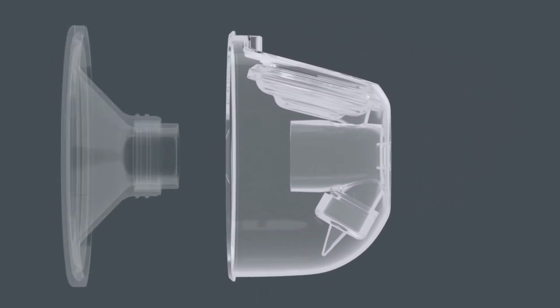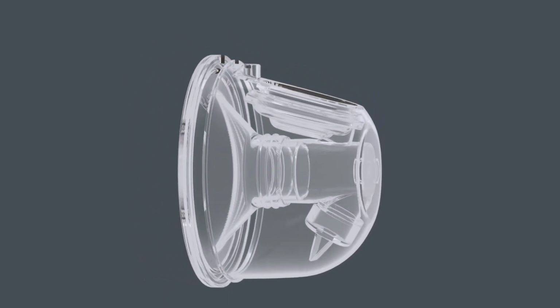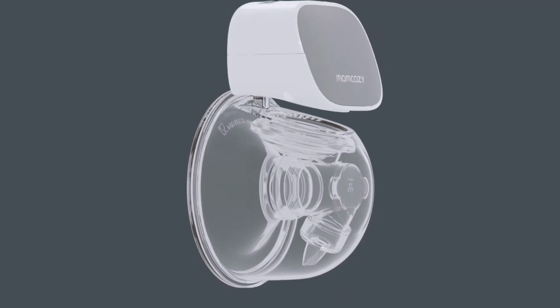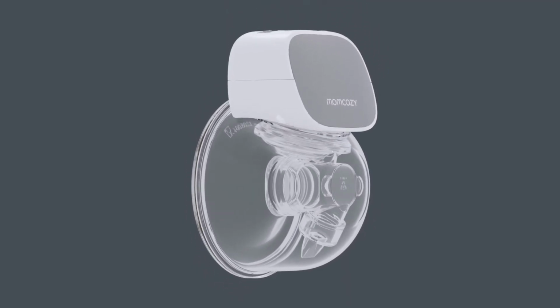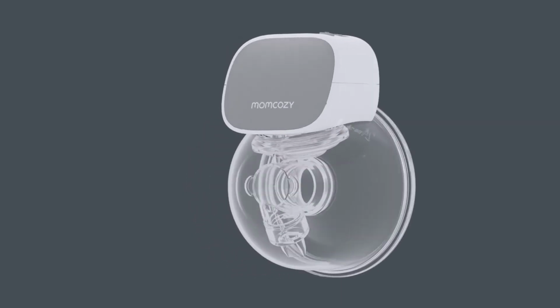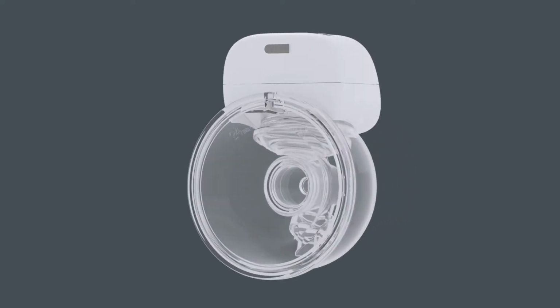When the milk bowl is installed with the flange, after aligning the milk pouring outlet, press the edge of the flange to install it. The silicone ring is detachable to assist in the tight connection between the milk collector and the breast pump. It is recommended to replace the accessories in 1-3 months according to the actual situation. In order to maintain a good sealing condition, ensure correct installation.